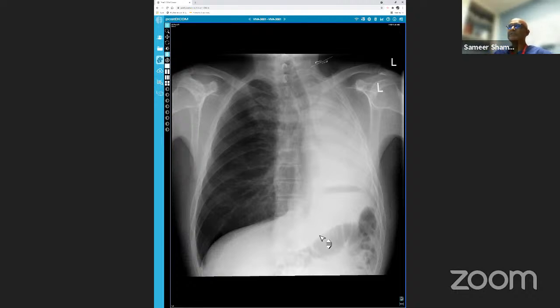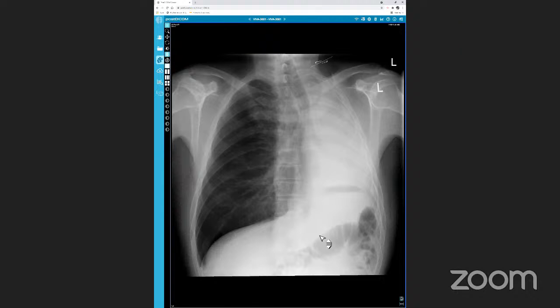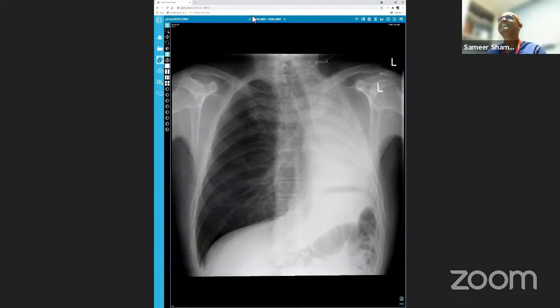Okay. So when you get unilateral whiteout lung with loss of lung volume, there can be only two things happening. One is the patient has had a surgery, as you mentioned before, like a pneumonectomy, and therefore the lung is not there. Or the second is the patient never had a lung on that side, which is the case. So pulmonary agenesis is a congenital abnormality. In any other cause of unilateral whiteout, there will be mass effect to the opposite side. It's only these two conditions where there is loss of lung volume on the one side. Okay. Good. Next. And we'll read about that. Good stuff.